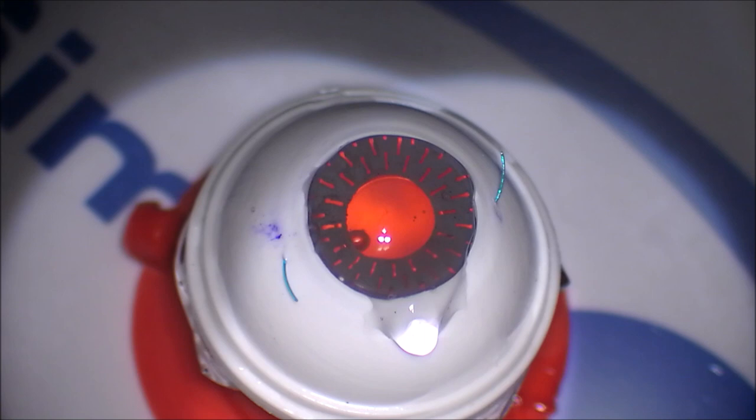The haptic pointing towards the ceiling and pointed up vertically means there's very little scleral shelf. And therefore, this lens is most likely to tilt. That's one pearl that I'm sharing with you now. If you pull the needles out and your haptics are pointed vertical, then that's a bad, bad scleral needle placement.